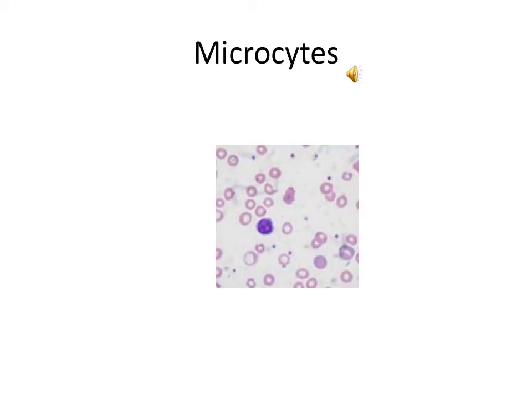You'll be clued in to looking for microcytes when your automated machine gives you an MCV reading of less than 80 femtoliters. You'll go to your peripheral smear and look for a very small lymphocyte, a small lymphocyte having very little cytoplasm. Red blood cells that are normocytic should appear around the same size as the lymphocytes. As you can see in this peripheral smear, these red blood cells are smaller than the lymphocytes, some significantly. In this picture, the microcytes are also hypochromic. Just keep in mind that microcytosis doesn't always go with hypochromia. Sideroblastic anemia and lead poisoning produce a lot of microcytes that are usually not hypochromic.